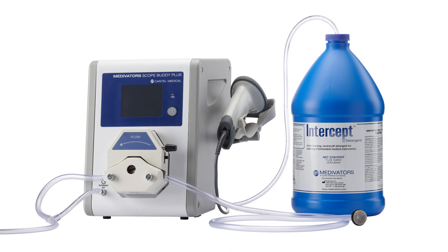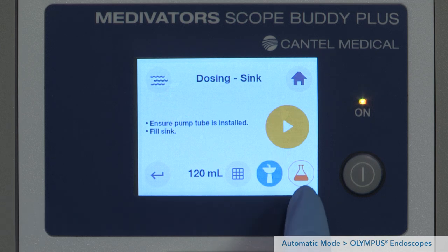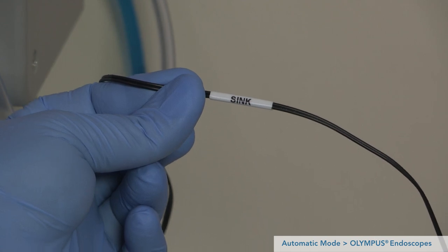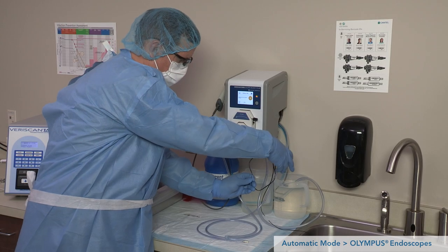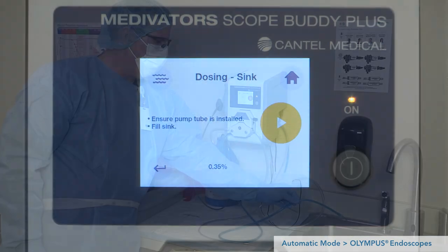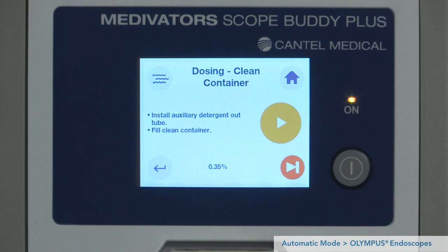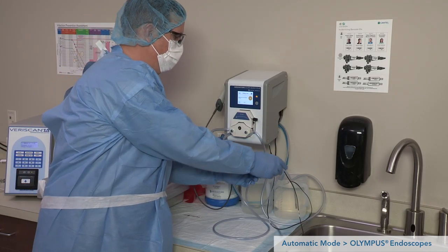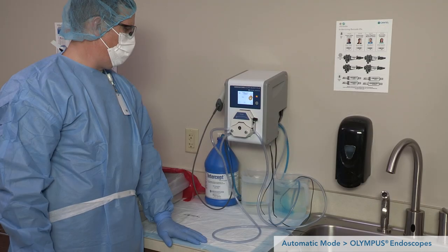The unit will automatically dose to the sink first, then the clean container. Fill both the sink and clean container with the correct volume of water previously entered in first-time setup. Place the temperature sensor labeled 'sink' into the sink and the one labeled 'clean container' in the clean container. Press play to begin dosing detergent to the sink. You will be prompted to dose to the clean container; place the weighted end of the 24-hour auxiliary detergent out tube into the clean container and press play to begin dosing to the clean container. This completes the dosing step.